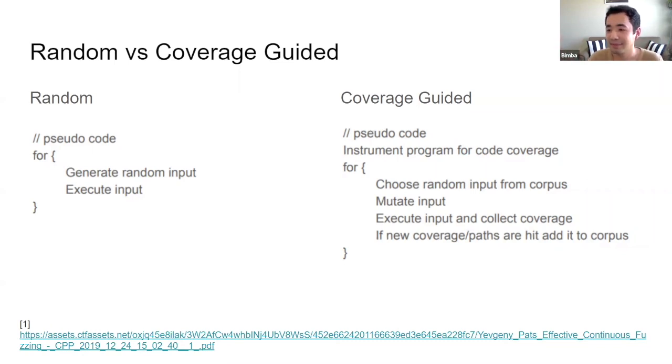Got it. And are there tools that can help you form that corpus? Like maybe there's some runtime instrumentation that you can add. I think so. With Clang's libFuzzer, you can just give it some noise or random data, and once it finds a bug, it gives you an output directory full of random sequences of bytes, and you could use that as a corpus. I don't know exactly how it works. Most of the time, I think the recommendation is to manually craft it so you start off with a solid base.